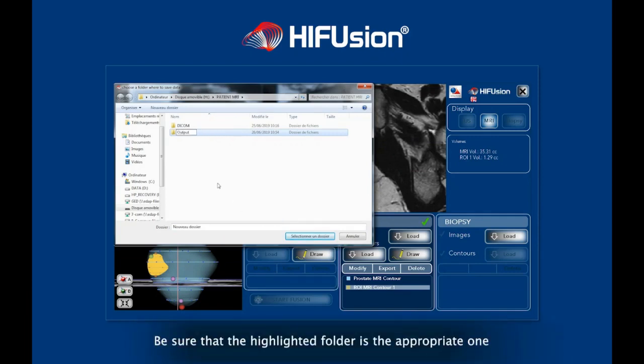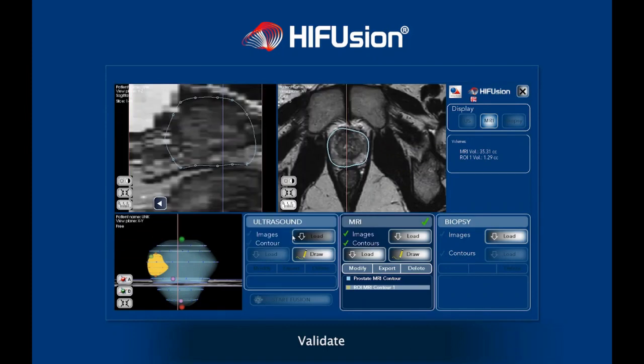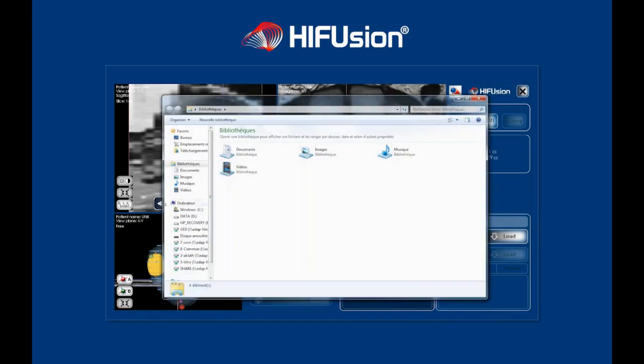The fusion is now complete and the system is ready for the customer's arrival. It is advised that you perform a practice simulation prior to the customer's arrival. If you have a colleague with you or there is OR staff, administrators or office staff available, give them a test drive and warm up for the main event.